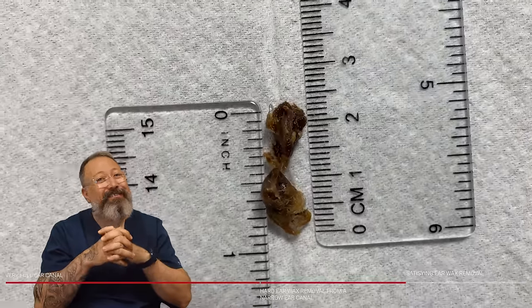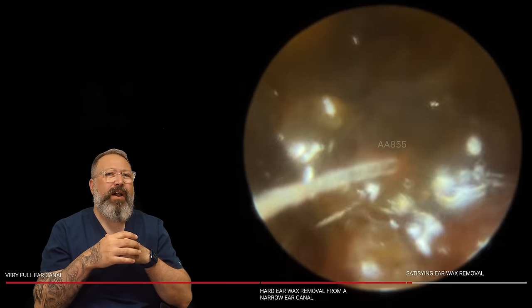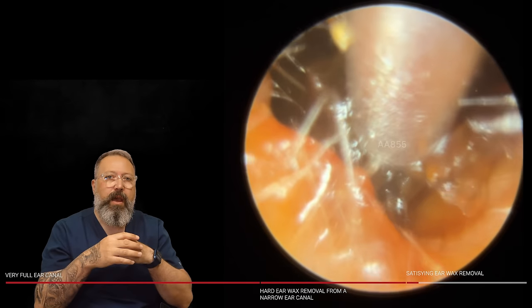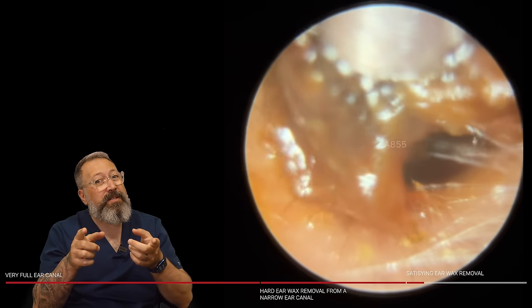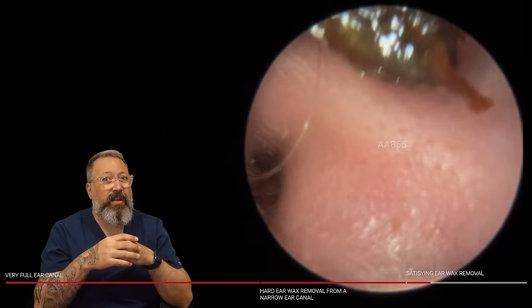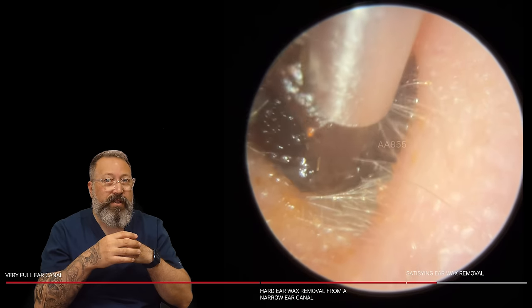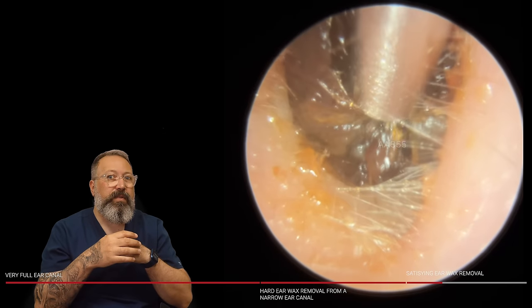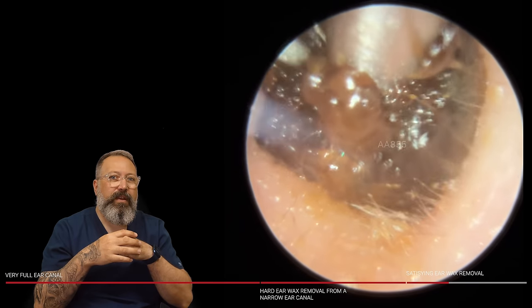You can tell he's getting close to his holidays now. Very wet, sticky-type wax. While I'm on the subject, don't forget to check out Friday's video — that is an immense wax removal, a big one. Getting this piece out here — in fairness, I didn't think it was going to come out as easily as that. It looked really wet and sticky, a bit like the first patient in this compilation. But actually it came away really nicely and drew the next section down with it, which is always nice to see. When you get a good grip and the whole thing starts to pull forward — that's what we like. You can see when you put the suction tube in, that wax almost wrapping around the suction tube. Out that comes.